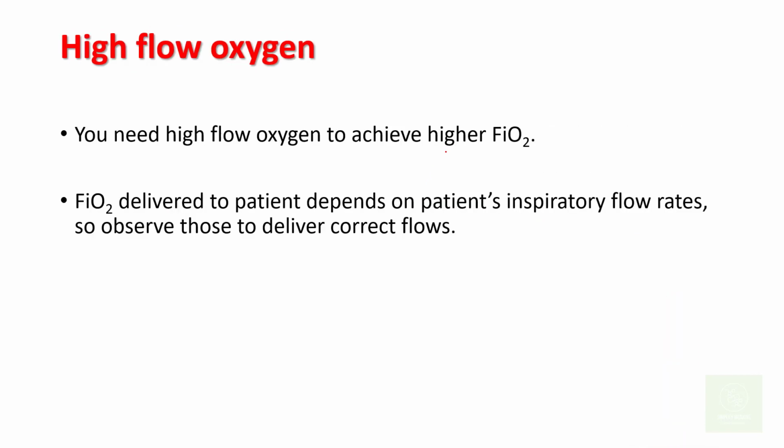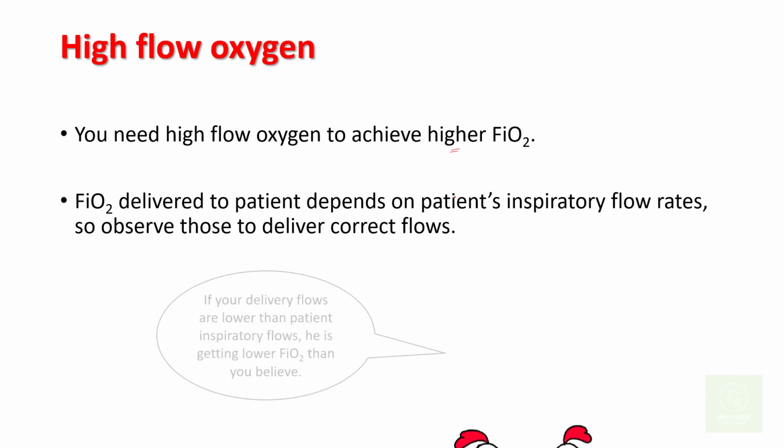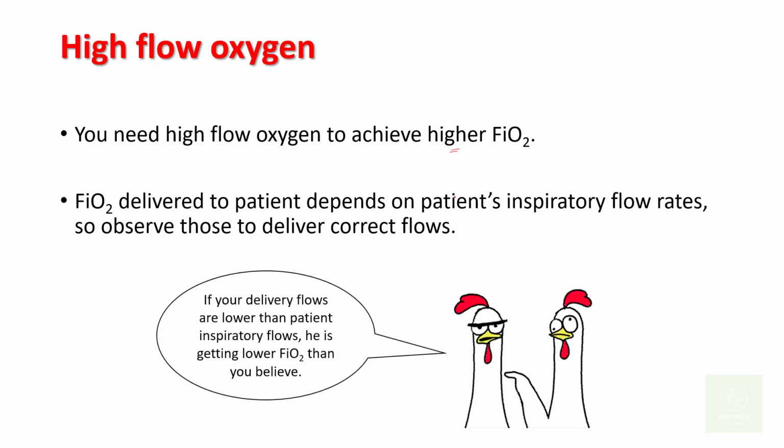You can achieve higher FiO2s pretty easily. However, still the FiO2 delivered to the patient depends on the patient's inspiratory flow rates. So if your patient has an inspiratory flow rate of, say, 80 to 100 liters per minute, you will be getting lower FiO2 than you believe.